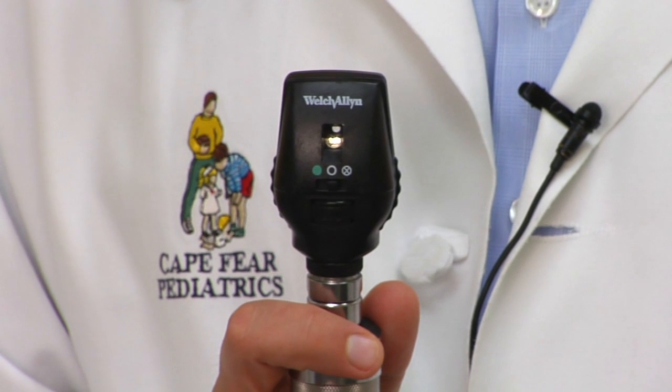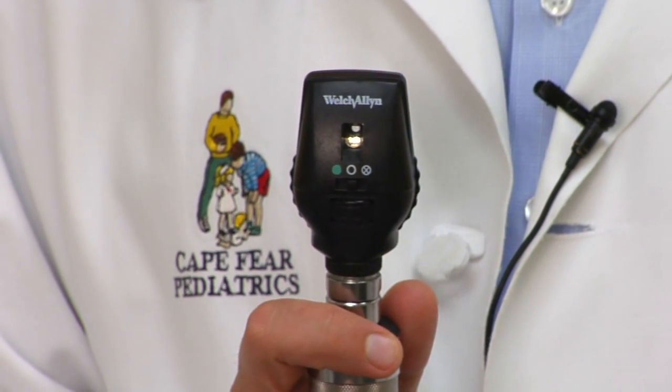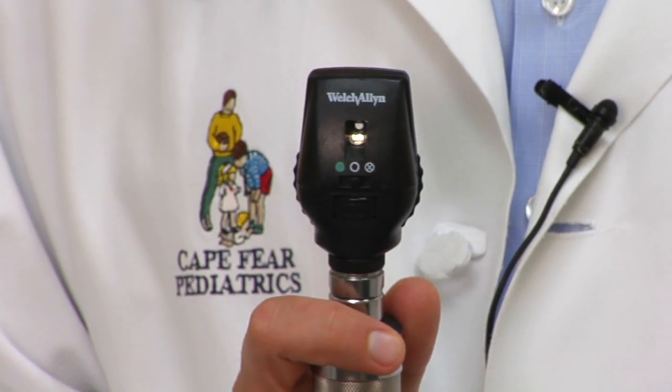The one we usually use first is this — it's an ophthalmoscope, and it's used for looking in the eye. I'm going to shine a light in the child's eye while I look through this little hole to see. When I talk to kids, I say, 'Here's a flashlight — do you like to play with flashlights? So do I.' And then I might ask them to look at something on the other side of the room if they're old enough to do so.